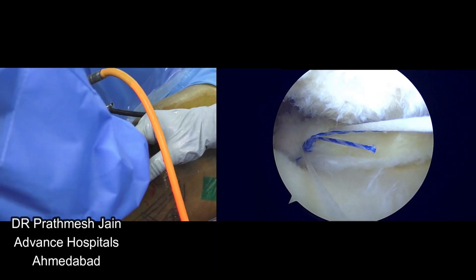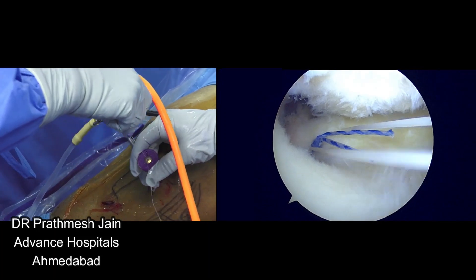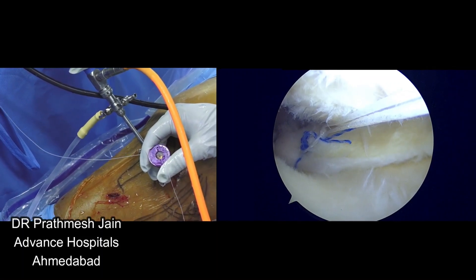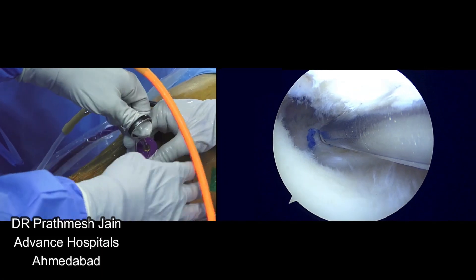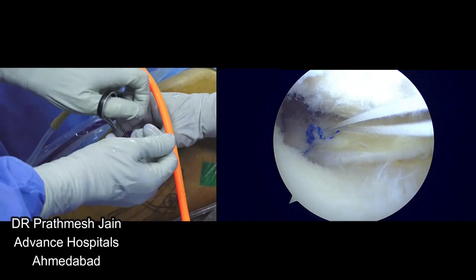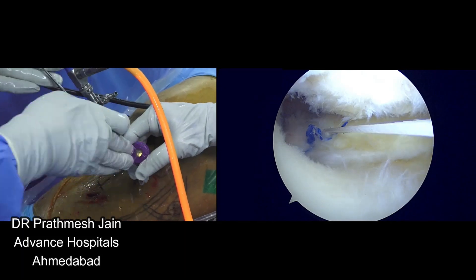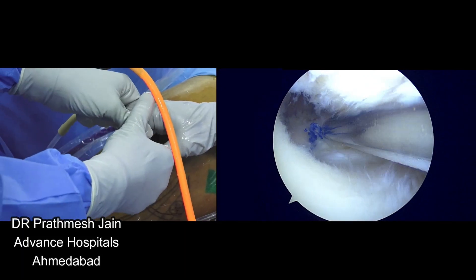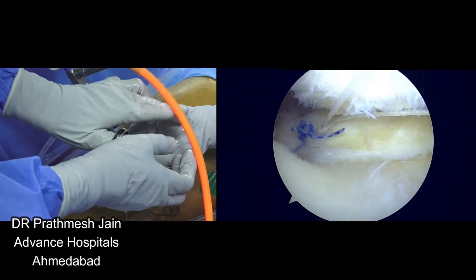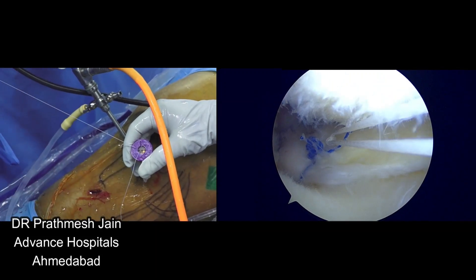Structurally this makes a very solid repair. Supposedly if you have a root tear with a radial component and a stump lying there on the root, this is a very useful modality because this technique allows you to do a margin convergence side-to-side repair, which is not available in the conventional trans-tibial technique. Here we have passed and tied the suture in a mattress fashion and the root is very nicely attached at its position — both sutures are very nicely tied and you can see the torn root is now attached. You cannot even see where the root was avulsed — it is almost like a native normal root attachment.